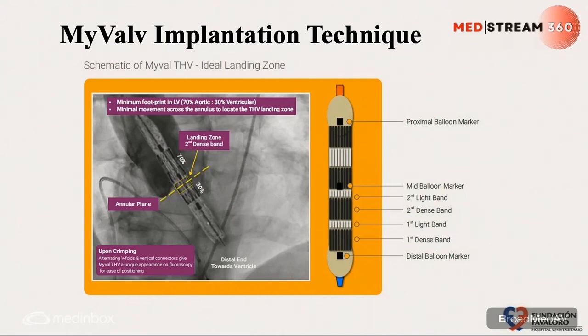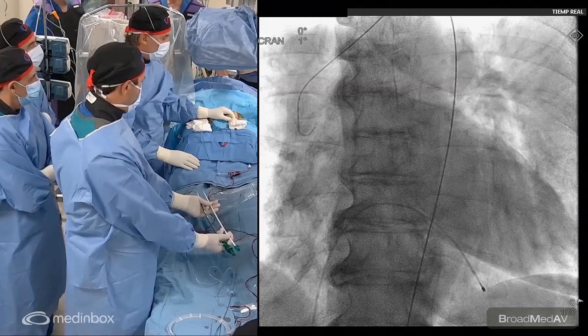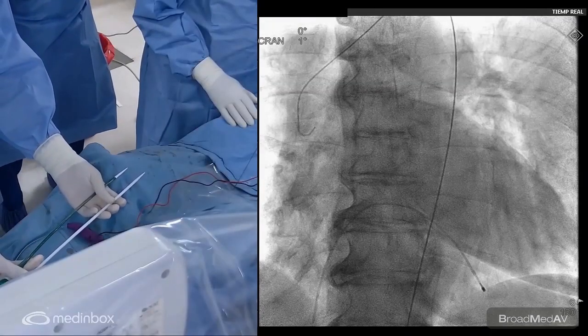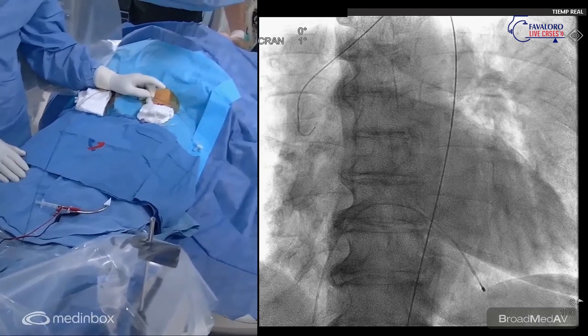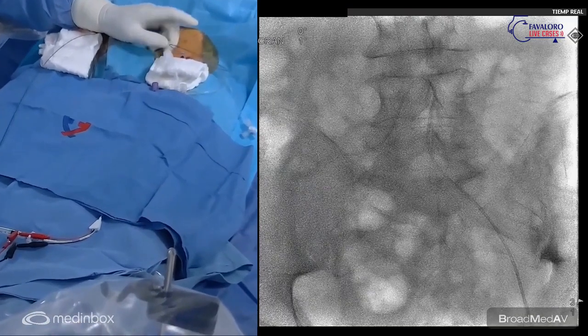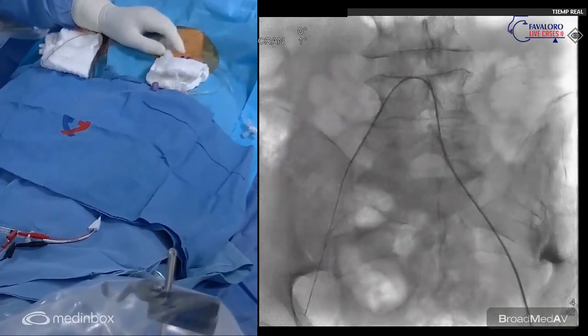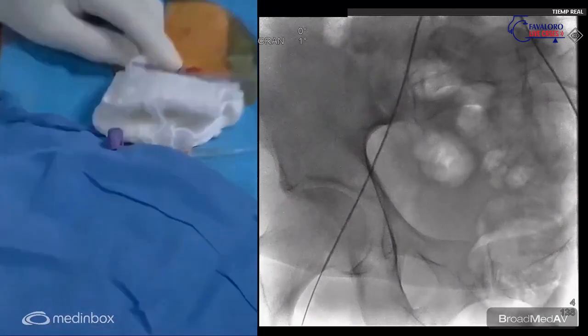Okay, great. So this is the sheath. Let me explain what we have already done. She has previous conduction disturbances. So let's go to real life, to camera one or two. Here we put the femoral introducer for a transient pacemaker that we are going to pace from. And we will also leave the wire at least for 12 hours to check if any new conduction disturbances appear. Remember that we talked in the last session that previous conduction disturbances are the most important predictor for new or worsening ones. So we have done a crossover and we have the anchor there.